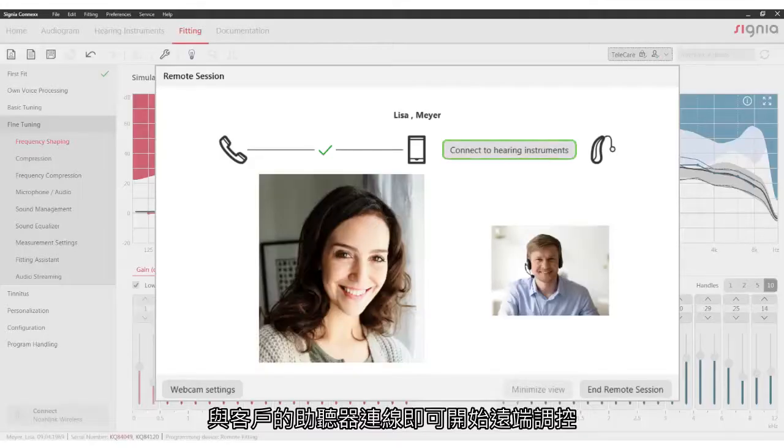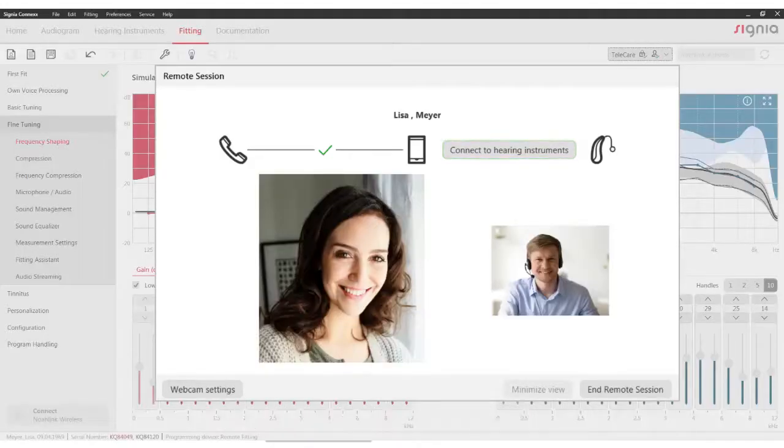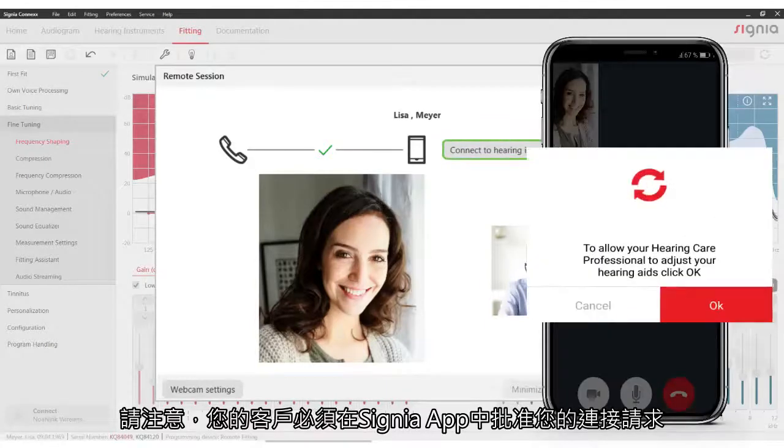Connect to your client's hearing aids to start remote tuning. Please note that your client first has to approve your connection request in the Signia app.